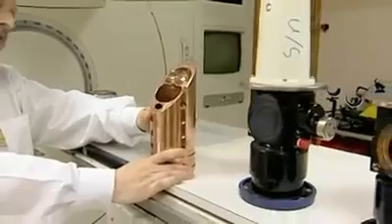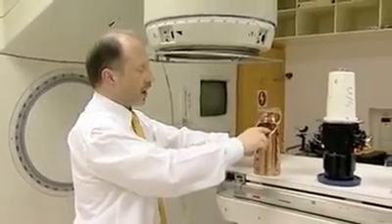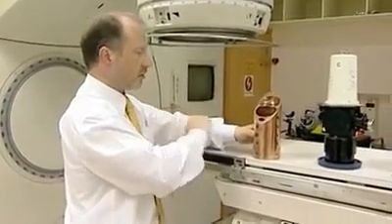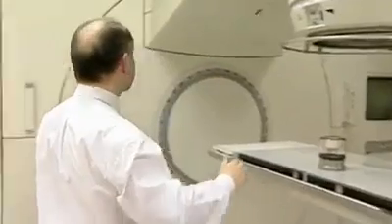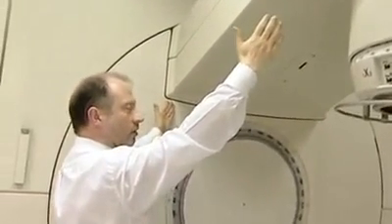The accelerating structure is basically a one and a half to two meter copper tubing with accelerating cavities inside it. And this structure sits approximately here in the gantry of the unit.